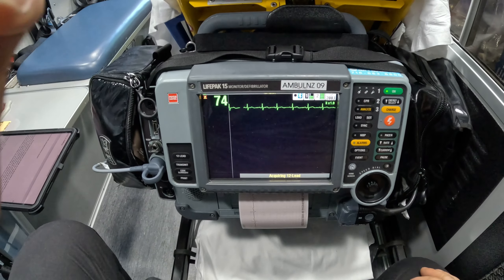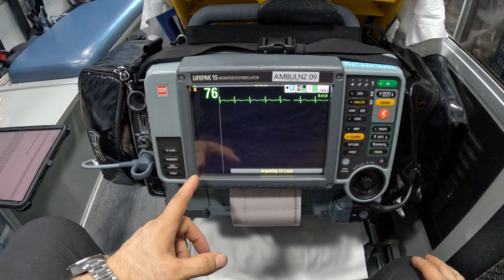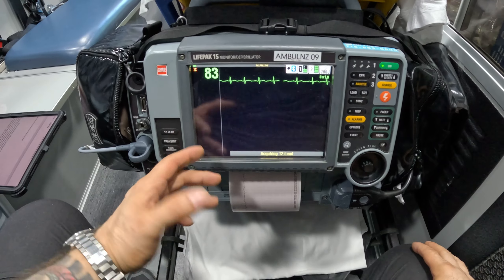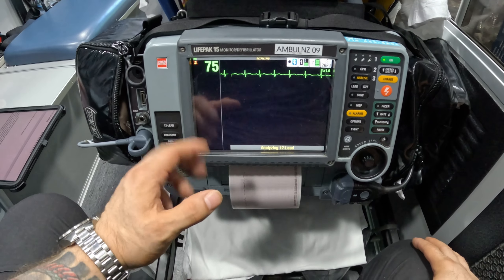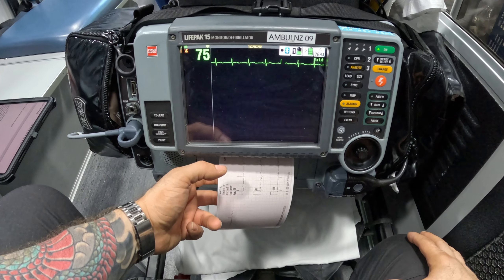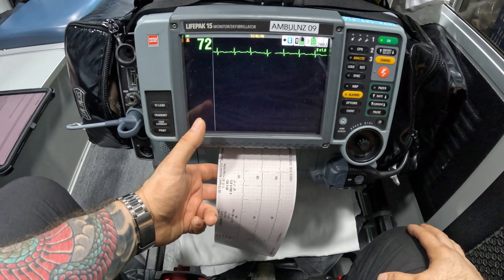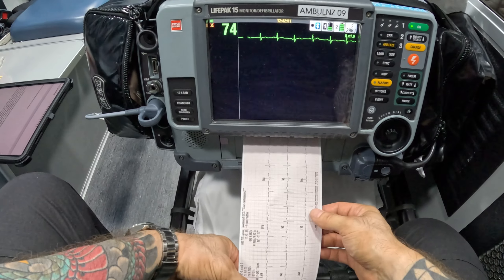And you basically tell your patient: please stay still, do not move. It's going to acquire the baseline 12-lead and print it out. Once the baseline 12-lead is printed out, everything is going to be based on this 12-lead. I don't expect any pathology with him — I'm not expecting any ST segment deviation up or down. But we need the initial 12-lead for us to start the training.